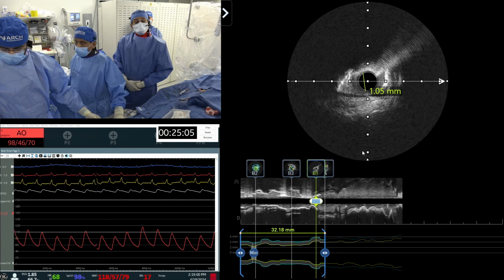Yes. Okay, so we are ready now with a 1.75 burr. Go to our steps, which we say at the Y connector here, just a tap on the Dynaglide.